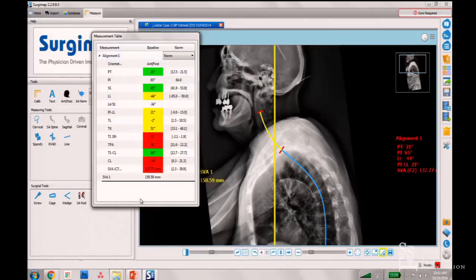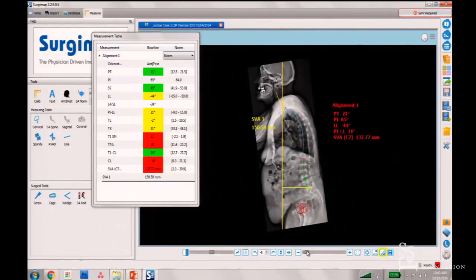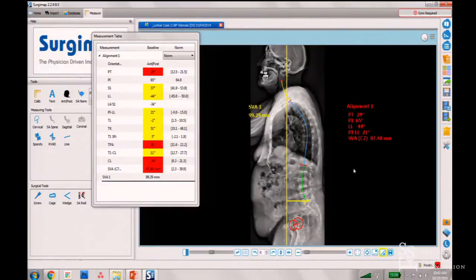You can also look at thoracic kyphosis — 50 degrees on this patient. The SVA is 14 centimeters. The SVA is supposed to fall over the sacrum; if I remove the pelvic rotation, it's way in front. You want the SVA to be less than 4 to 5 centimeters, meaning it falls over the sacrum or just slightly in front.